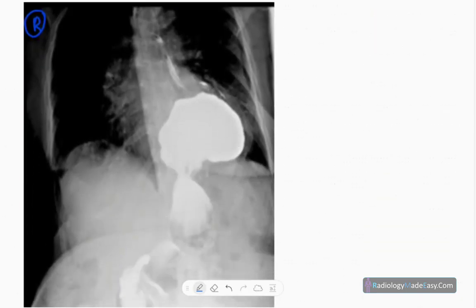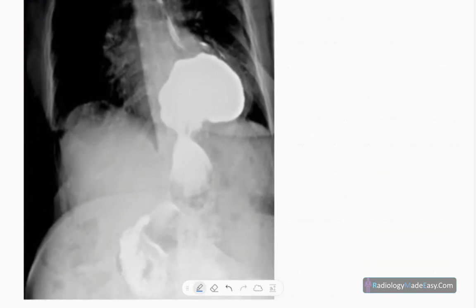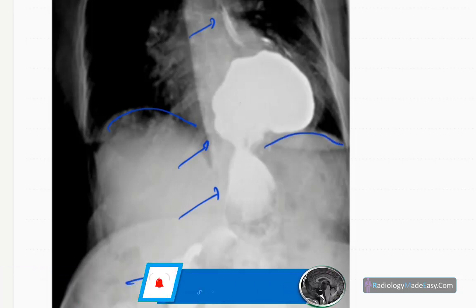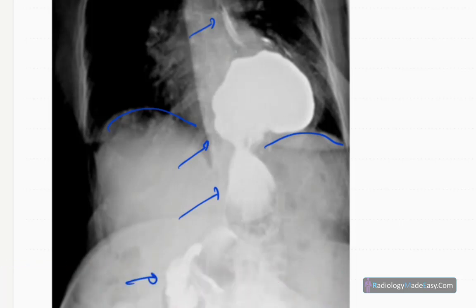This is the anterior-posterior spot radiograph of the barium swallow series. You can see a normal contrast column here. You can see the diaphragm here, so there's a structure above the diaphragm level or esophageal hiatus.